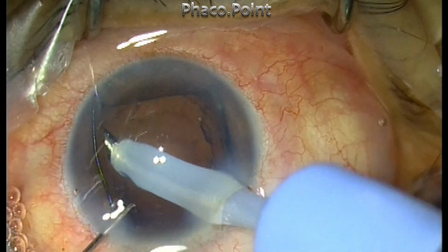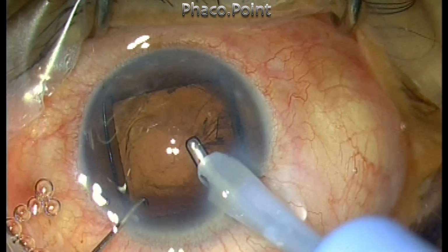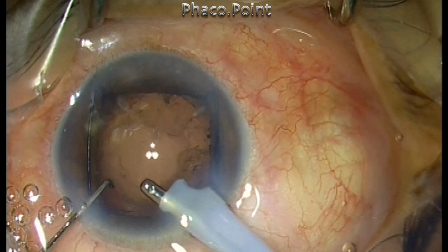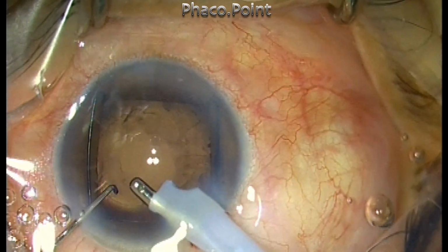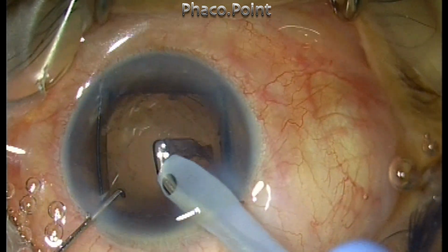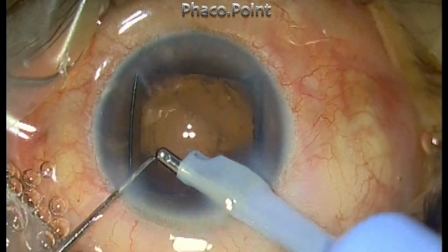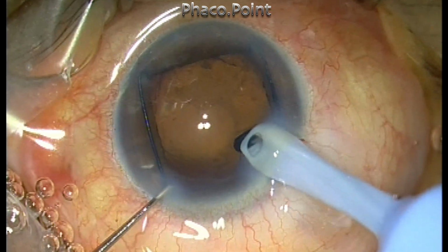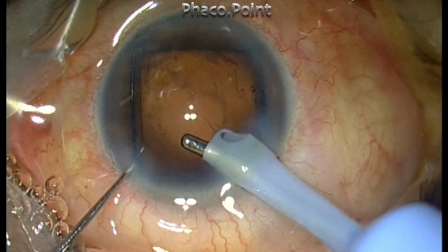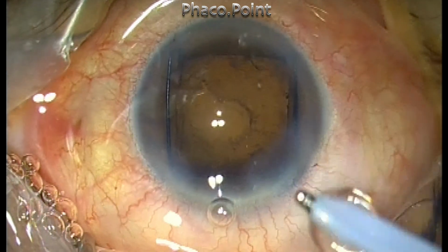Once I started doing the coaxial IA, I found that the capsular bag central portion was extremely mobile and kept trampolining. The capsulorhexis size was about 5.5 millimeters, and while trying to access the peripheral cortex, the rise of the central portion of the capsular bag was making it very difficult for me to access the cortex in the periphery. The minute the fluid is pulled out, the central portion of the chamber collapses. Now this is an indication for the use of the CTR.